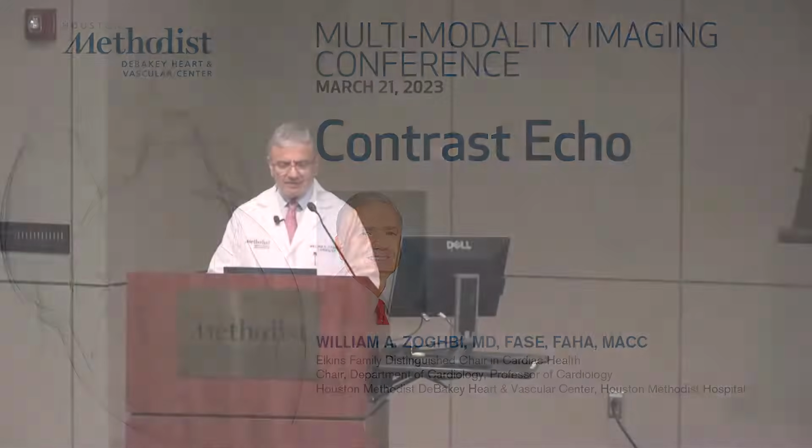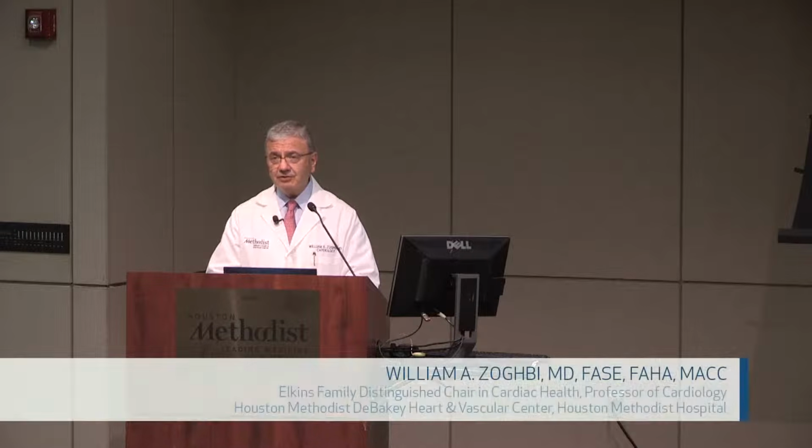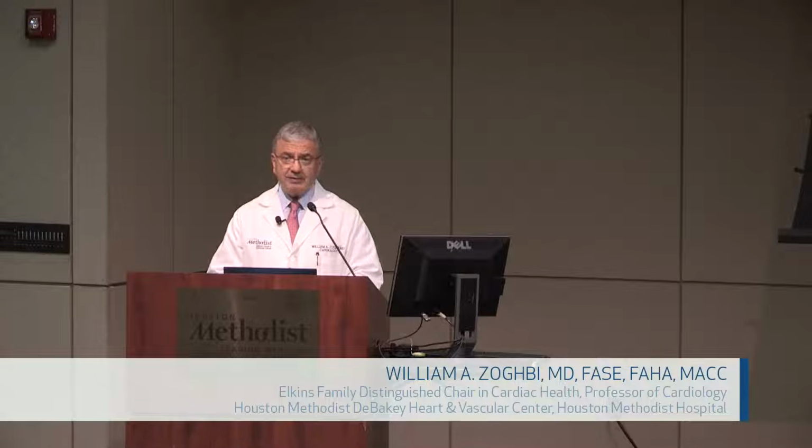The topic of today is contrast echocardiography, also called ultrasound enhancing agents. The topic is very germane because nowadays using ultrasound enhancing agents or even agitated saline is part of your armamentarium to diagnose cardiovascular disease better and enhance images. So you need to know the basics.